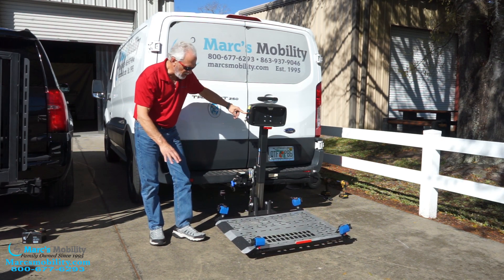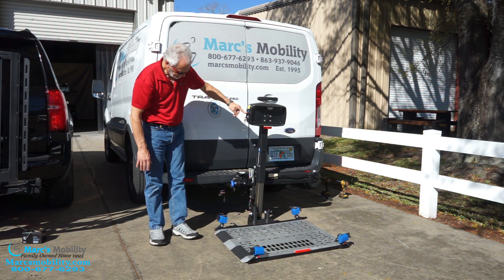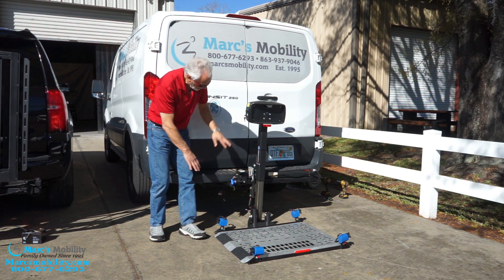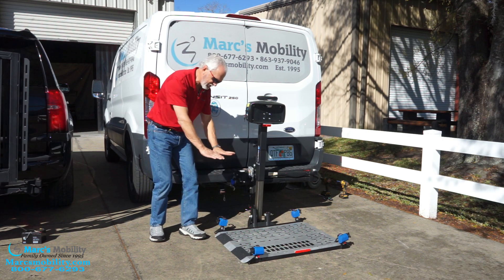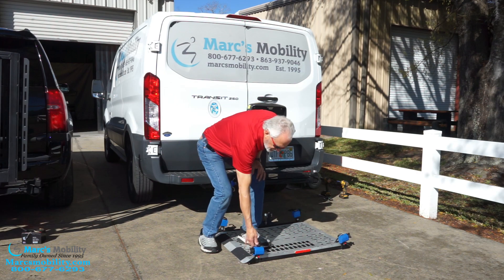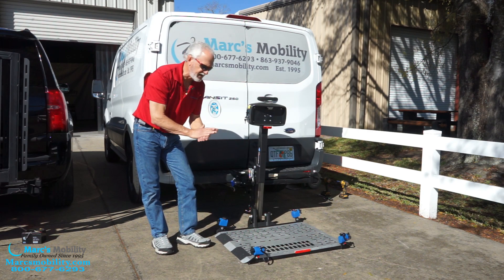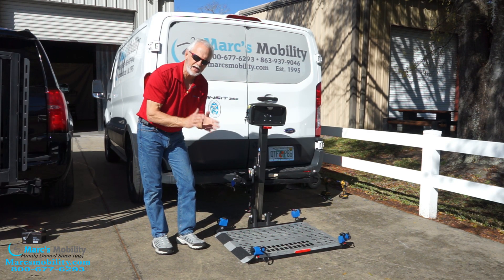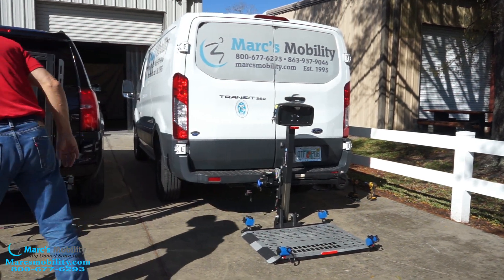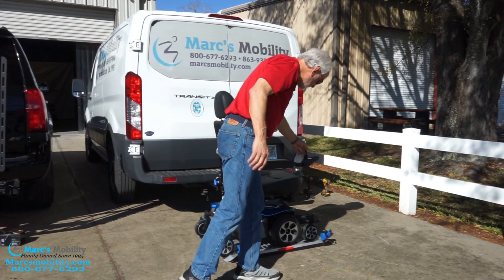You want to bring the platform all the way down until this corner right here — where my foot is — touches the ground. You want to stop there, because if you keep pushing down, you're going to raise your car. We just want to put the lift down to the ground. Once it's on the ground, make sure your straps are facing outward. You can put any wheelchair on here that's got four or six wheels, as long as the wheelchair is not any wider than 26 inches. I'm going to bring a very popular chair — this is called a Jazzy Air 2, six wheels.